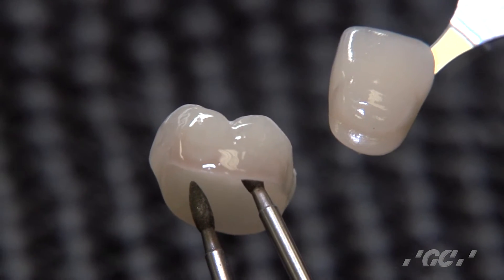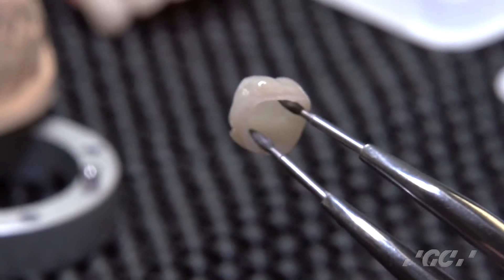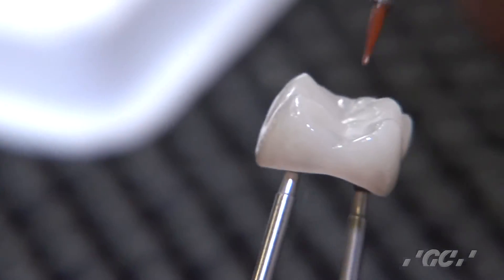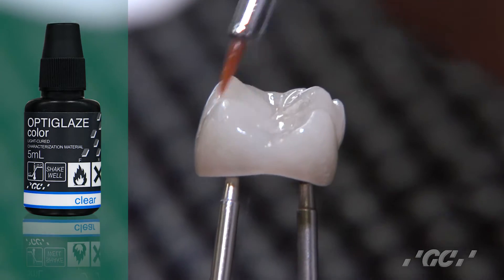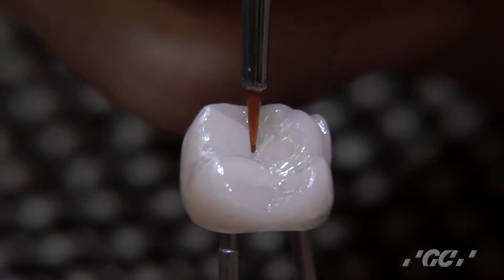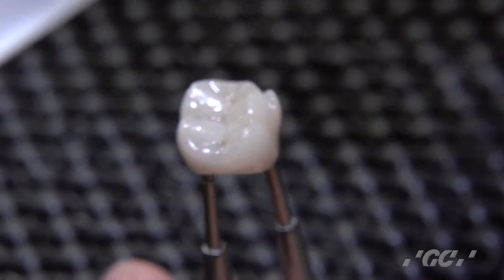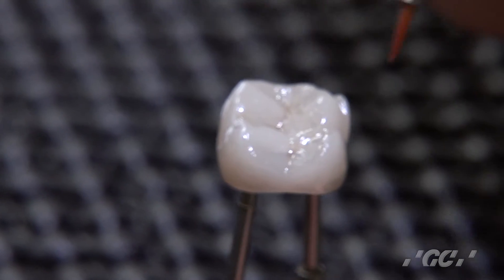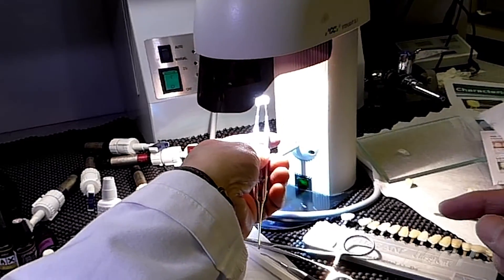Radial distal, radial lingual first. Next, I will take care of the color on the occlusal. I just finished the application of Opti-Graze color to all around the crown except the occlusal. Apply a very thin layer of clear first, then drop the color. I dropped some dark color into the grooves, then just clean up the brush and draw. Light cure it right away — otherwise the material runs all over.